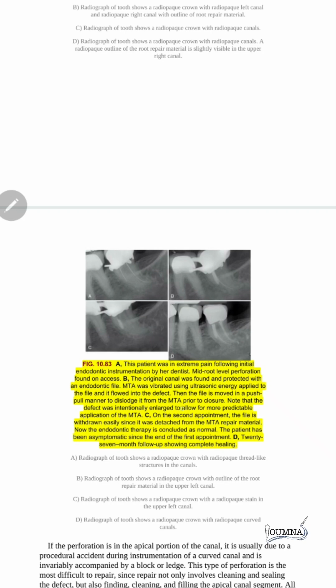the defect. Then the file is moved in a push-pull manner to dislodge it from the MTA prior to the closure. Note that the defect was intentionally enlarged to allow for more predictable application of the MTA.